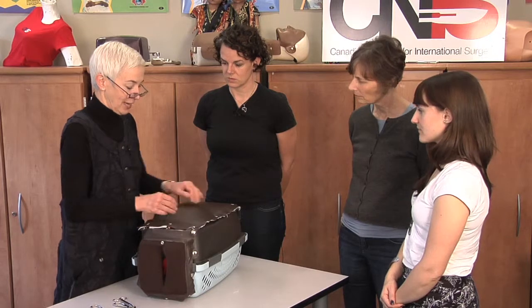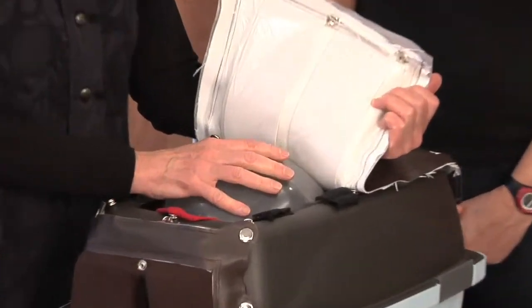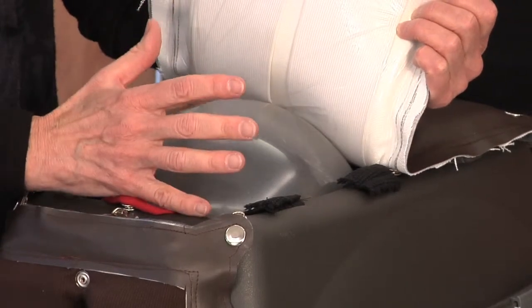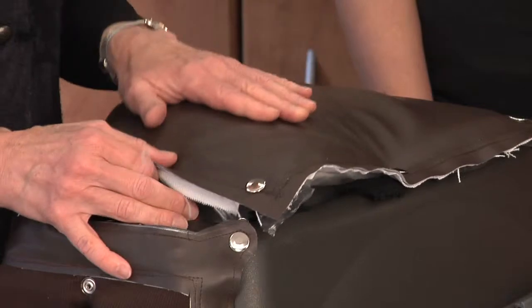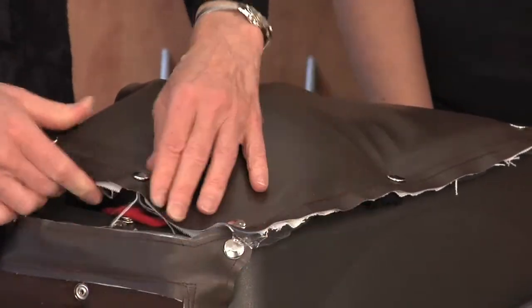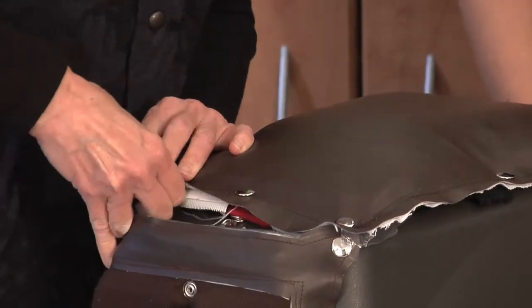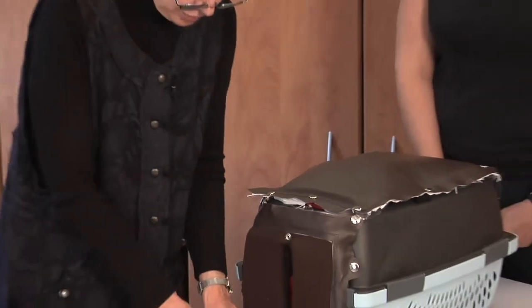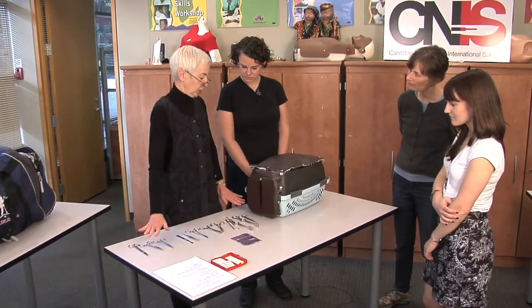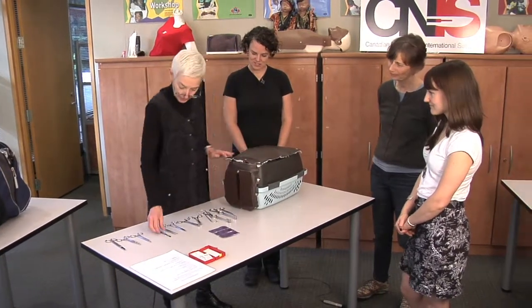The exercise we're going to do now is the laparotomy. What we do in the course is put a balloon inside and blow it up. This balloon could represent anything — maybe the patient has a bowel obstruction and the bowels are all filled and pushing against the abdomen, or maybe it's the bladder or a cyst of the ovary. You don't want to hurt it on the way in, so we put the balloon there pretty full and tense. Before we begin, we go through a list of all the instruments needed, just like any operation — normally nurses would do this ahead of time. So this is our patient, and I'm going to make an incision here.